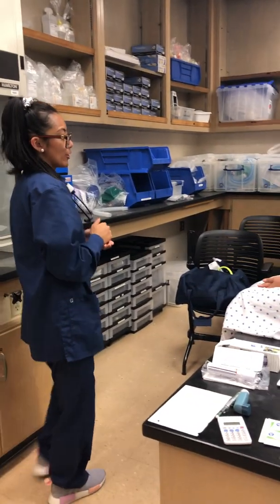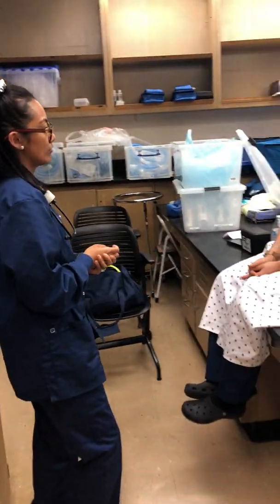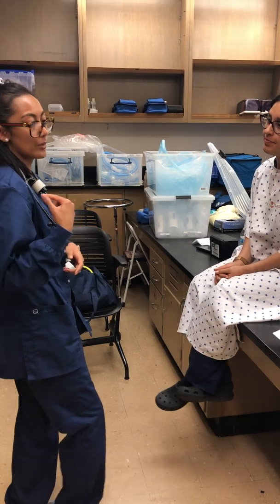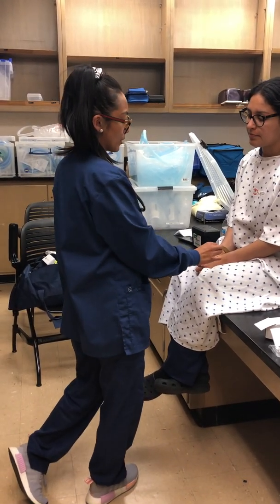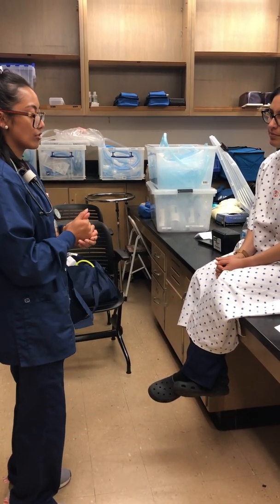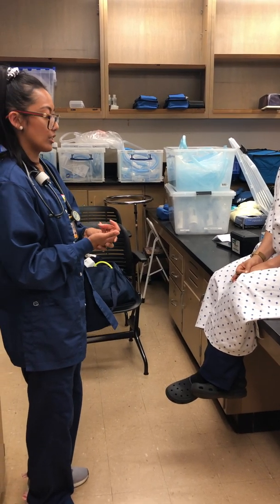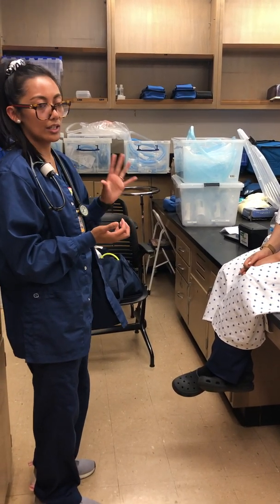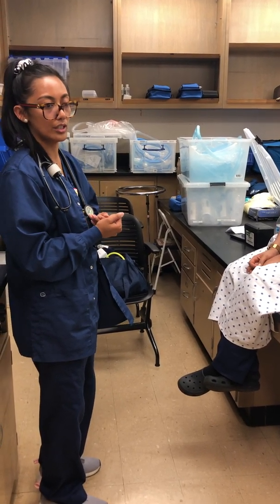Hello, my name is Bernie. I'm from the respiratory department. May I get your name and date of birth, please? Jocelyn Buzz, 10/29/1990. Okay. And from here, I would double check that her band does match the name that she gave me and her date of birth. And then also at this time, I would scan the room, making sure that there's no hazards. And if the patient had any family members present, which today she doesn't, but if she did, I would ask her if she would like them to be escorted out to give the patient some privacy.